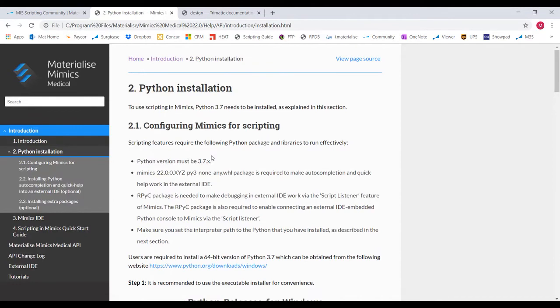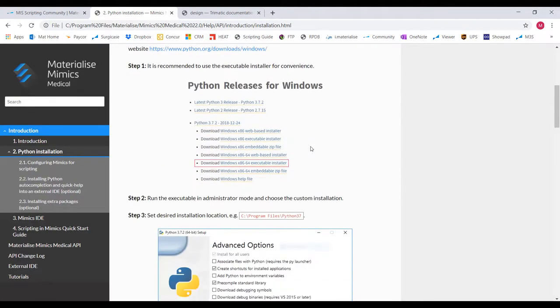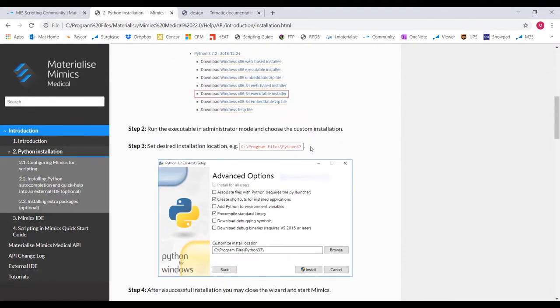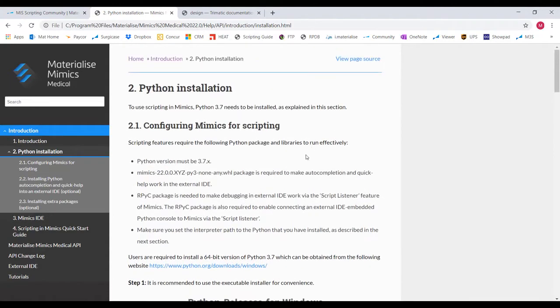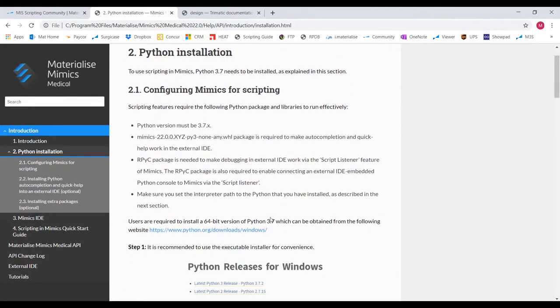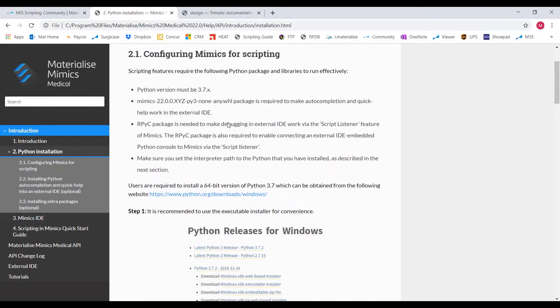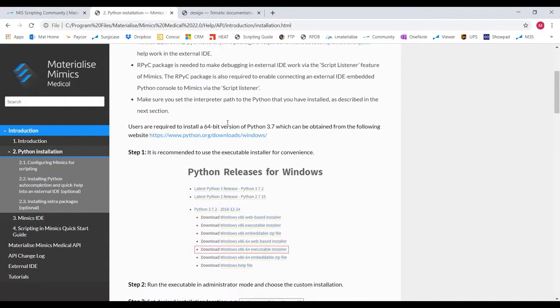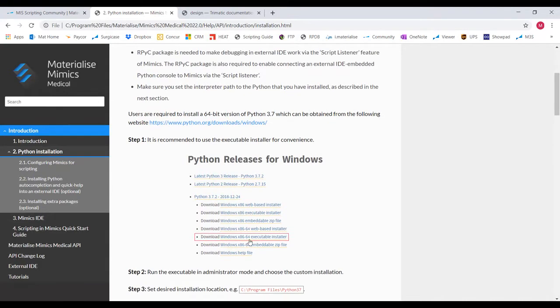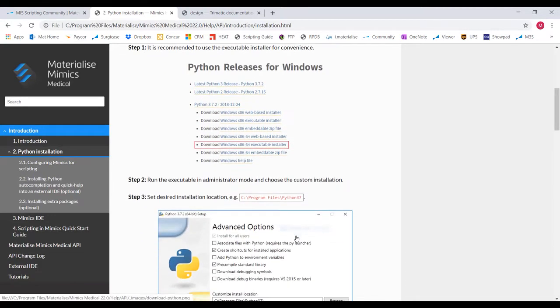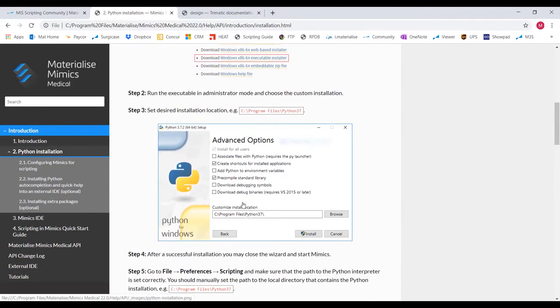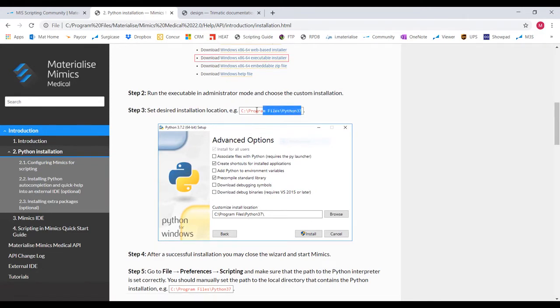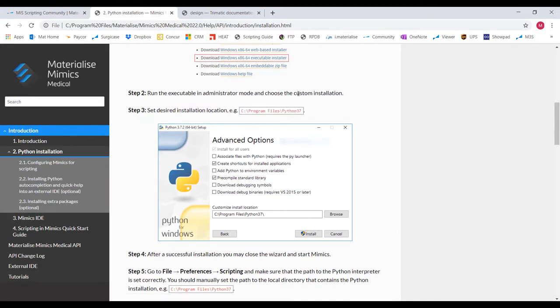If you go to the scripting guide for Mimics, you will find the whole section on how to install Python step-by-step. So first, go to this link here and make sure to download the version 3.7 point whatever. Also, make sure you download the 64 executable installer. Once you run the installer, it'll ask you to identify the folder location. Make sure to use this location for easier access.